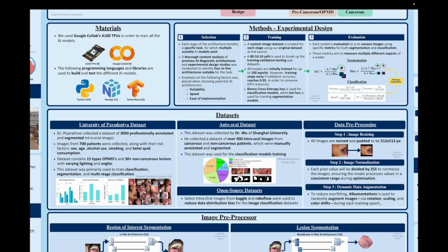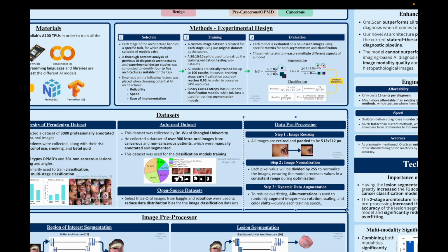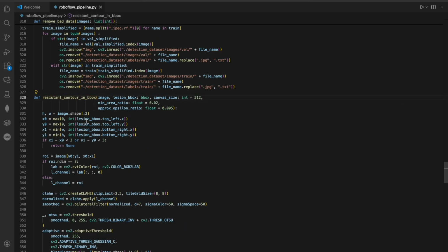A challenge I ran into early on was that many of the datasets only annotated with bounding boxes rather than the segmentation masks. To address this, I created several data standardization algorithms to generate size-relative segmentation masks for every image. Here's the integration I created for RoboFlow datasets specifically. This pipeline crops each bounding box and then applies a custom adaptive contour detection algorithm to produce a mask.